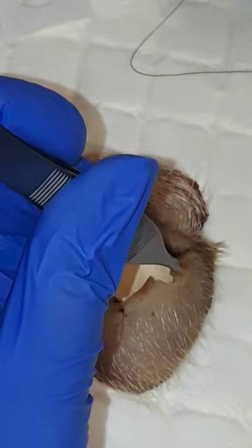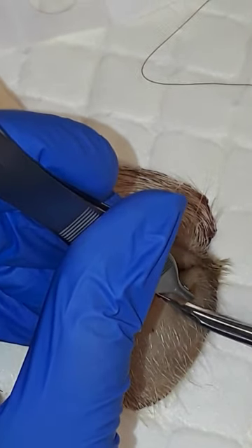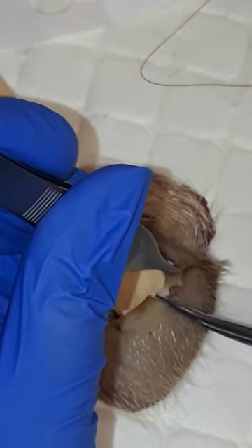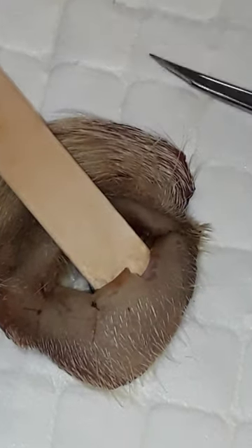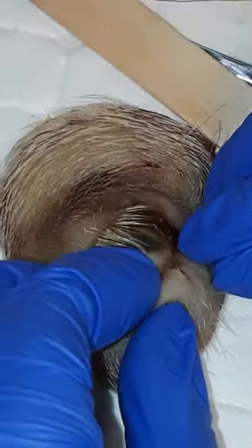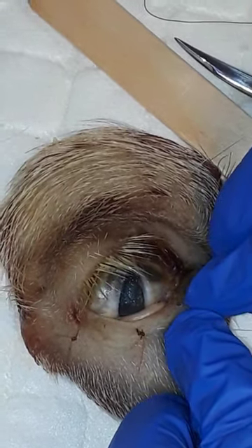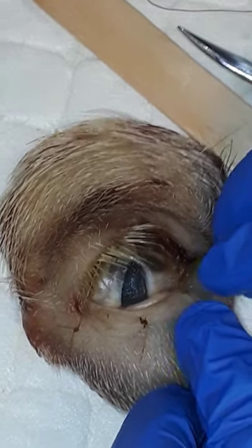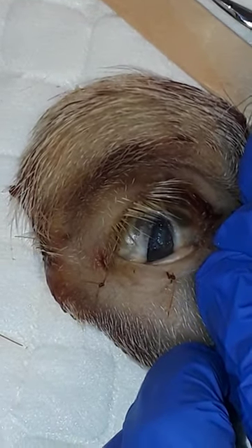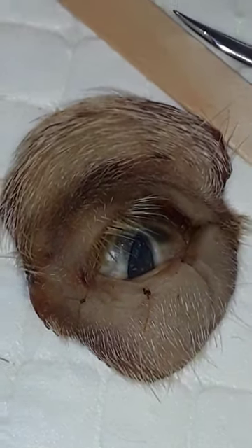You can also do a more pentagon-shaped or house incision. Remember you can't take out more than a third of the length of the eyelid. Now I've removed the wedge and I want to re-oppose the eyelid margin as perfectly as possible. This is definitely a point where you want really good magnification to identify the meibomian gland openings, which will be your landmarks — do as I say, not as I do, because I don't have magnification right now.